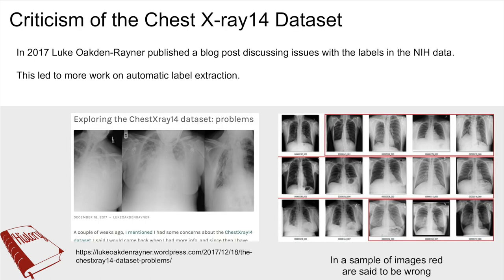One challenge in this field is labels. There has been criticism written about the discrepancies in ground truth labels on datasets, specifically the Chest X-ray 14 dataset. However, the issue of inter-rater variability for some radiological findings goes back as early as 1949 and likely can be a difference in clinical practice or medical background. This doesn't mean the models are not useful, as supported by the results of the Stanford study, but that special care must be taken in their evaluations.